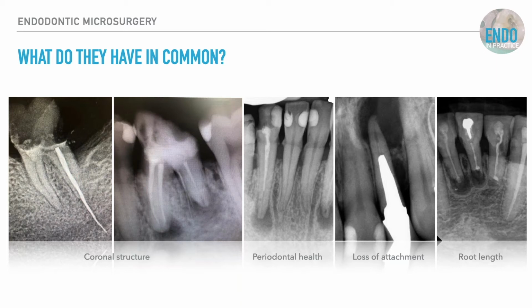So yeah, fundamentally for me, this is unrestorable. This is definitely unrestorable. The amount of plaque and calculus associated with these teeth and the poor endodontic treatment, not suitable for periradicular surgery. The amount of periodontal bone loss with such a wide post and little remaining dentine is most likely a vertical root fracture.